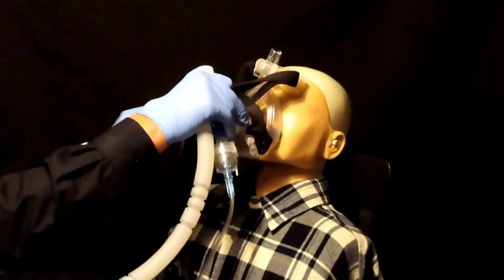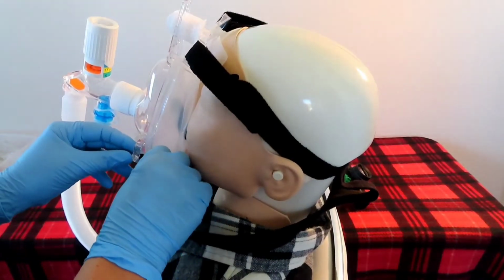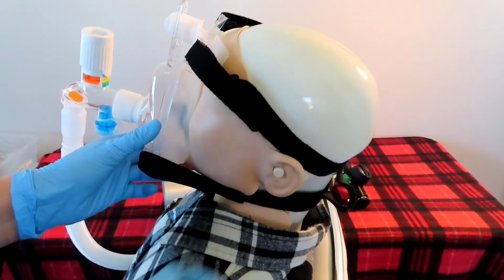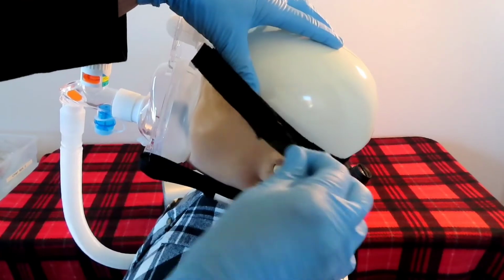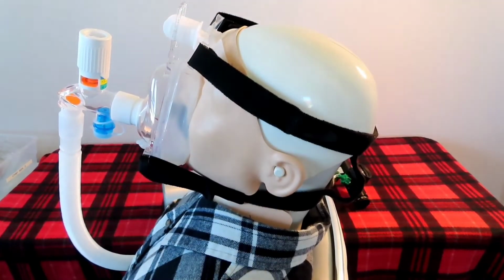For patients that are unfamiliar with CPAP, I would ask the patient to hold the mask and place it on their face in a position of comfort before I adjusted it and attached the head straps. Place the straps. And if needed, make any adjustments. Be sure to ask the patient to breathe normally and ask how they feel.